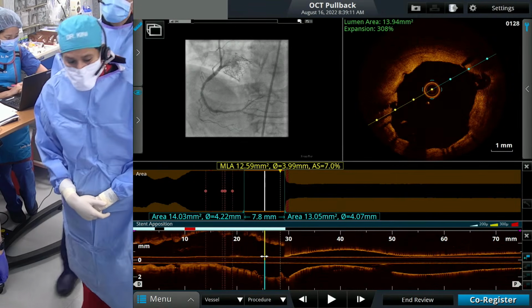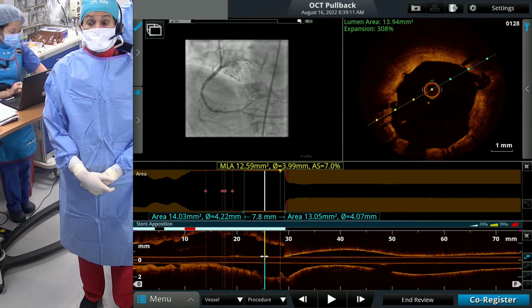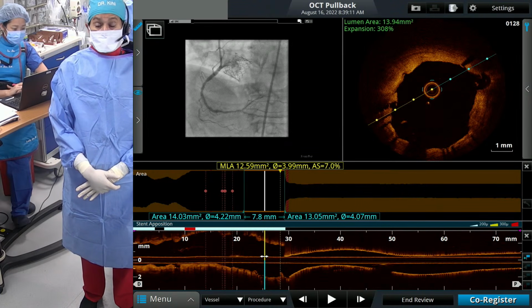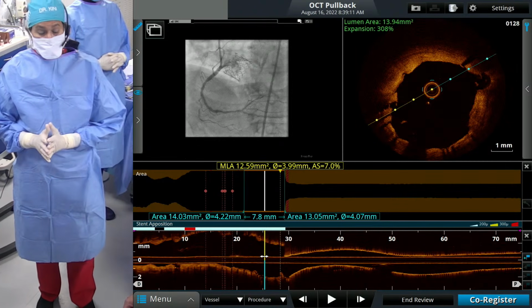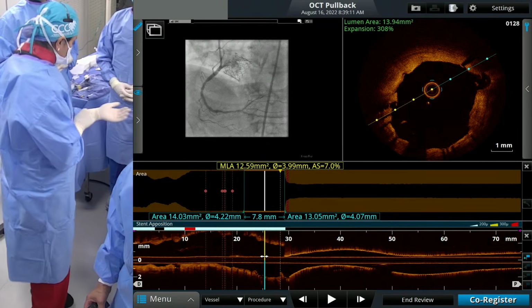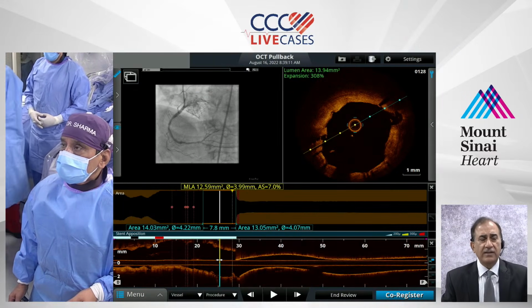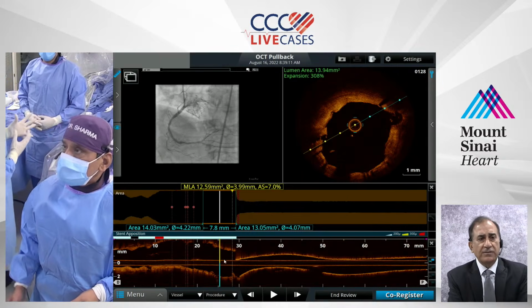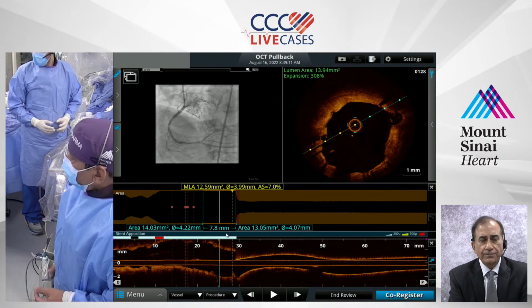I think we have explained it clearly now. I hope our viewers, if anybody has questions, can ask, because there are already a few questions that flew in before we got into this particular case. Several questions are asking whether we could have achieved similar imaging benefits with IVUS. With IVUS, yeah.